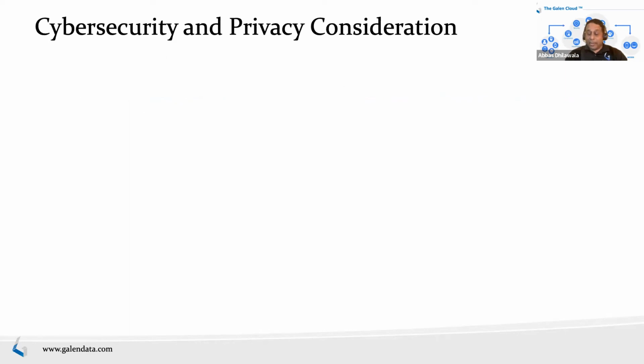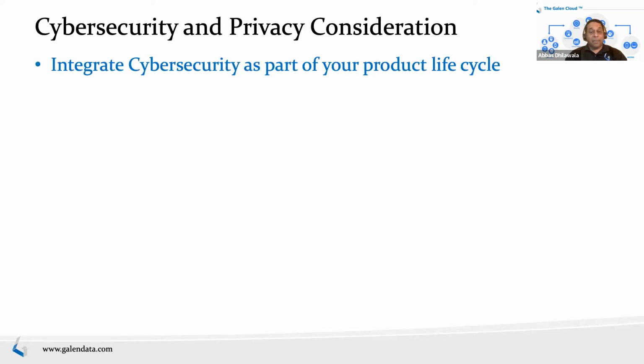Let's talk about a second aspect here, which is making cybersecurity part of your product lifecycle. Right. So there is a new guideline from the FDA that came out in April of this year around cybersecurity and pre-market submissions, and the FDA has worked on this through many years. They had a guidance in 2014. They came up with a draft guidance in 2018. Got a lot of feedback. The draft remained draft, and they came back with a new draft in 2022.